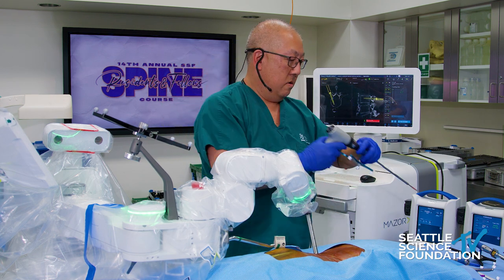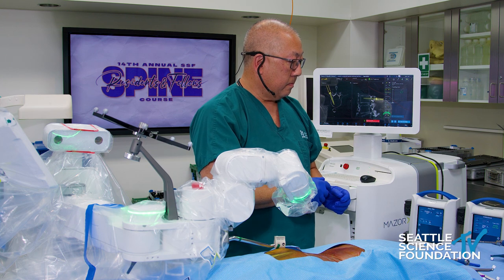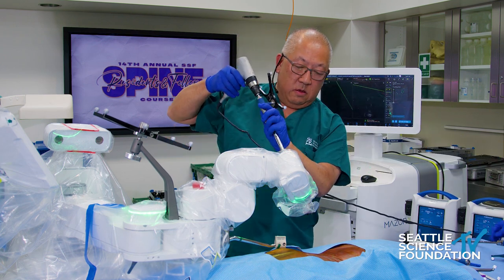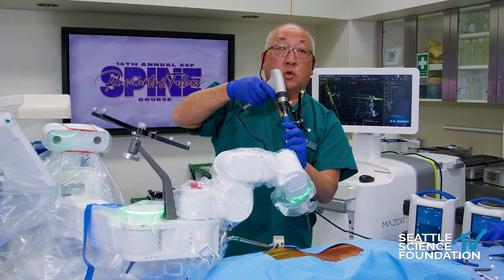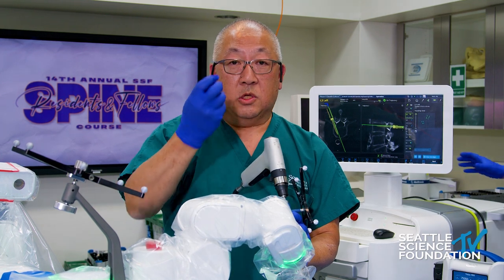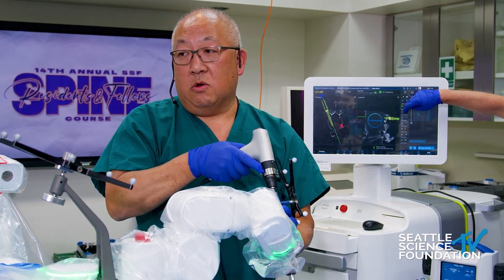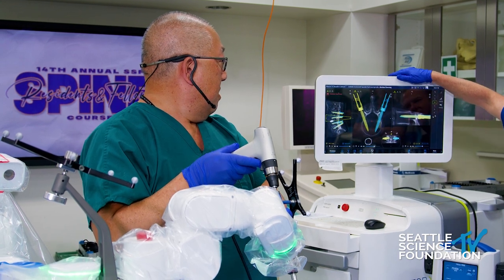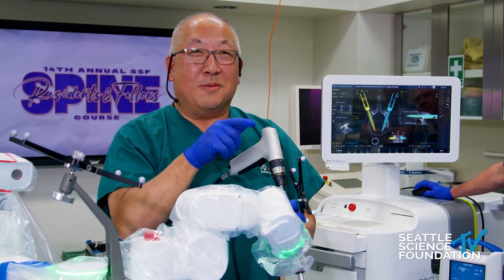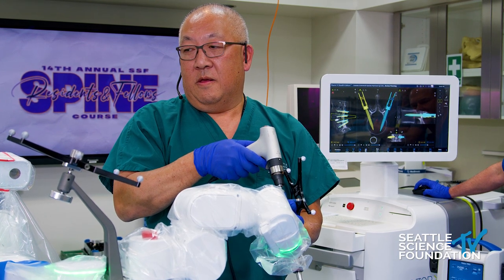I take the tap out, take the cannula out, and place the screw — again under power. I'll throw a little commercial for the all-tap screws. With a combination of all-tap screws, the way the thread pattern is designed and the tip of the screw associated with using power, literally the screw just gets sucked into the hole. It minimizes the risk of skiving and increases our accuracy of placing the screw. We've got the software loaded with the wrong screw system, so we're going to change that so you can see the navigated image with the screw going in.